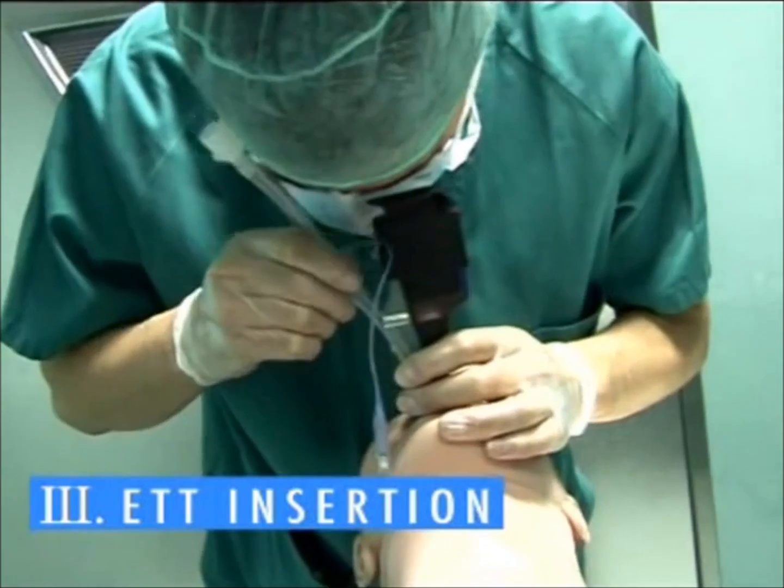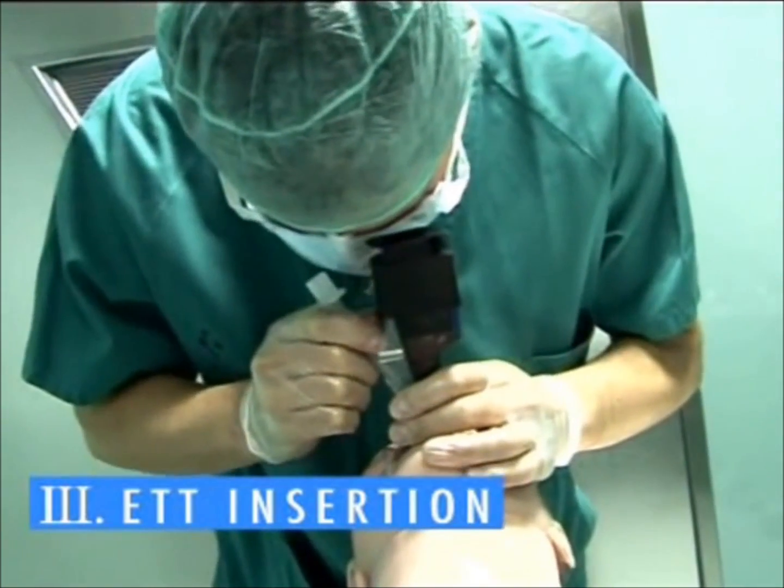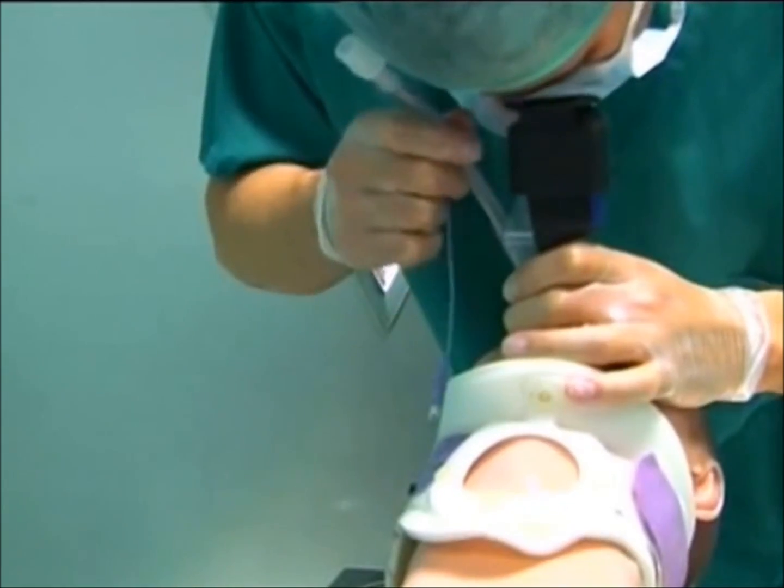Slowly push the ET tube in without twisting. Only advance when the vocal cords are in the centre of the image.